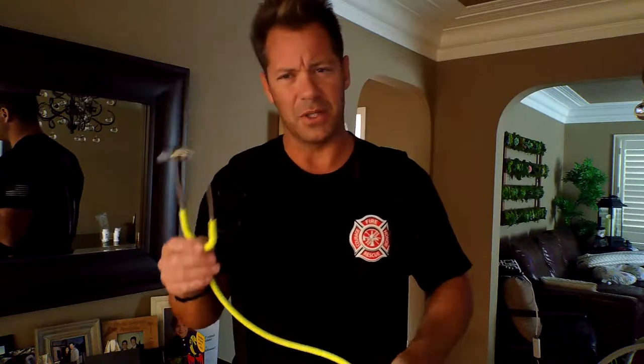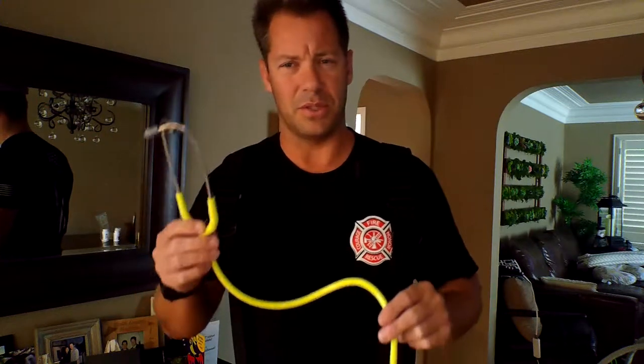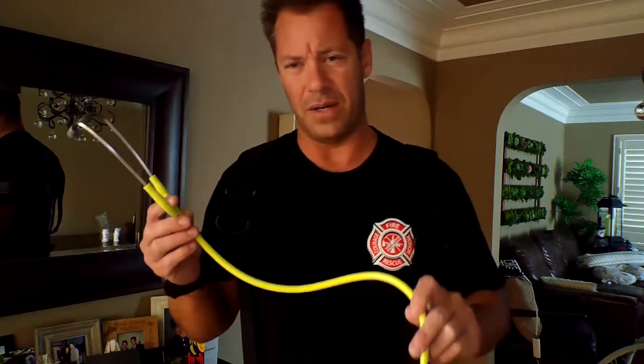Hi there, and welcome back to Firefighter Safety Tips with Firefighter Cafarada. I want to go over something else you might be interested in learning: if you do happen to have a stethoscope — you can buy them on Amazon and whatnot. I'm not going to go over blood pressures because it can get a little more complicated, but there are all different types of stethoscopes you could purchase. Look at the ratings on Amazon and you can find the one that suits your needs, as they'll give you a lot of feedback on which particular one works best.